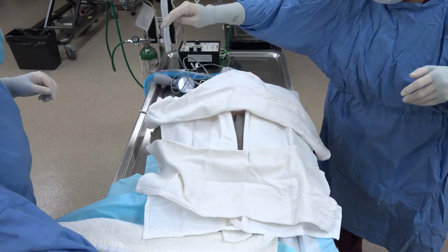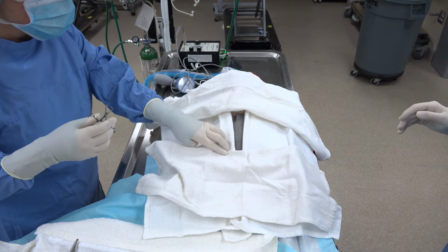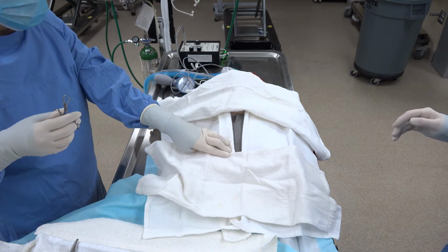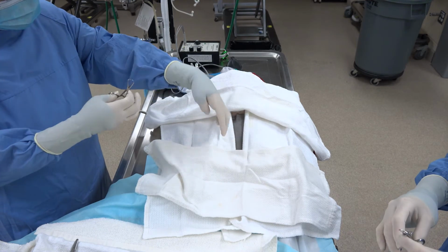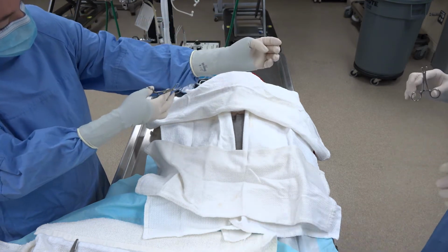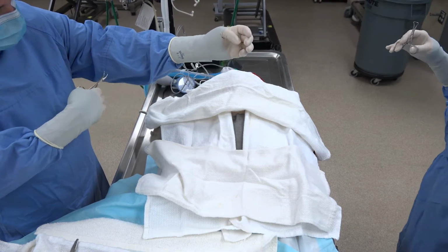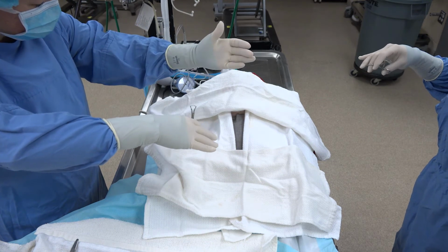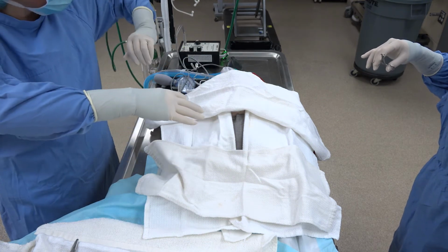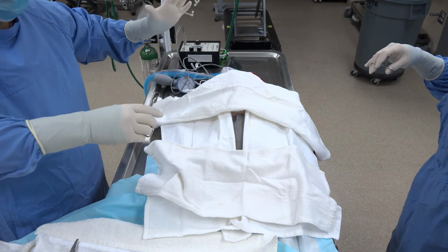All right, we've got our 4/4 drapes on. Now one thing for towel clamping, you can touch the tops of the drapes. You cannot touch anything below, you can't touch the table, and you have to mind your sleeves. See how puffy my sleeve is hanging out over here? If I'm not paying attention, this puffy part is going to touch the table. So I'm using my elbows up approach so that I don't accidentally touch the table, or accidentally touch somebody over here in anesthesia, something like that.